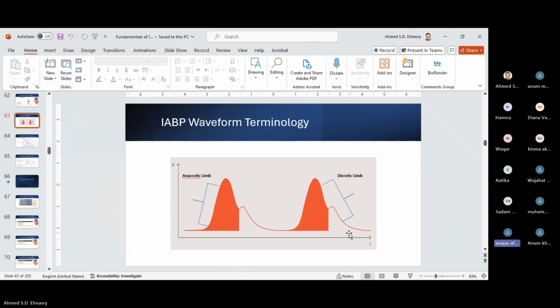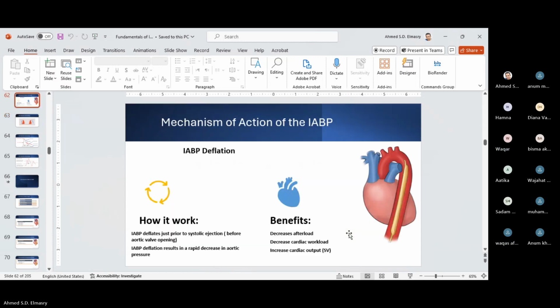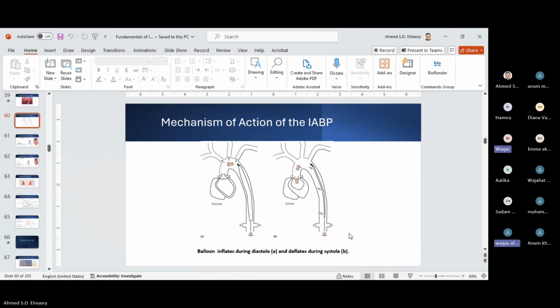Then how does the left ventricle get distended? Because if afterload increases, it usually increases the left ventricle distension. I have some confusion, just explain it.